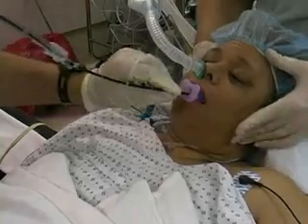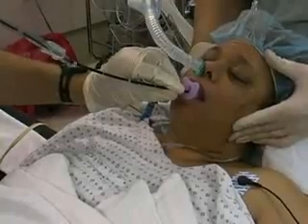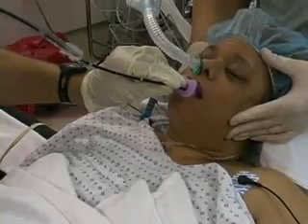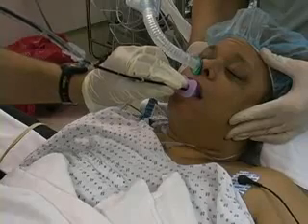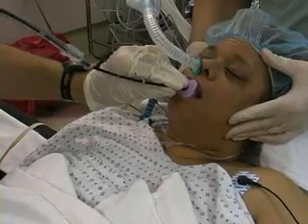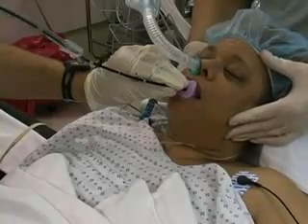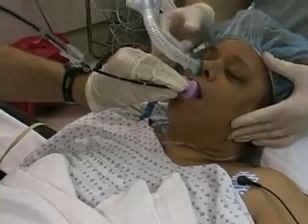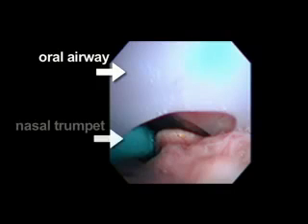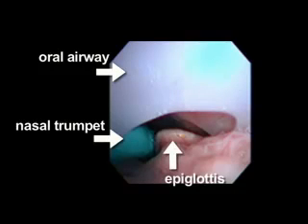Insert the fiber optic scope and endotracheal tube into the oral airway with the bevel of the tube facing the patient's nose, such that the bevel faces the posterior airway during the intubation. Keep the fiber optic scope aligned with the midline of the patient's mouth. Advance the fiber optic scope watching the video monitor. As you emerge from the oral airway, you can see the tip of the nasal trumpet and epiglottis.